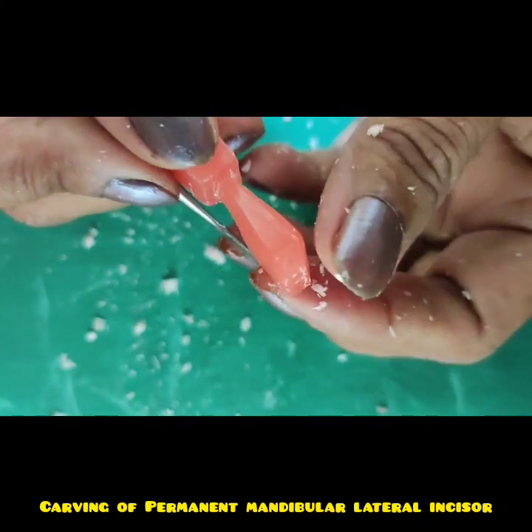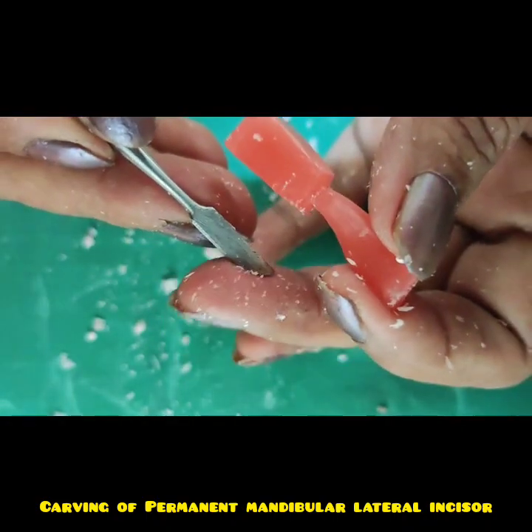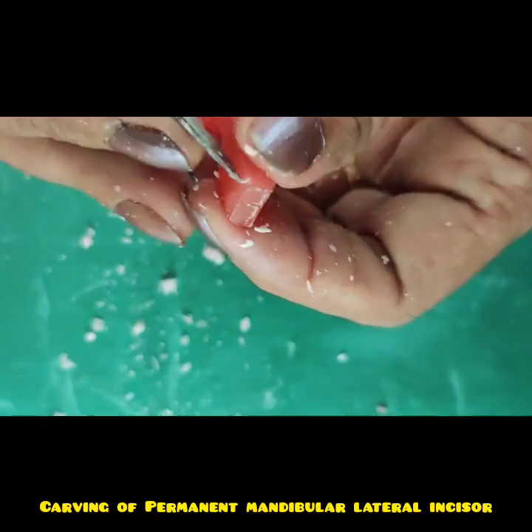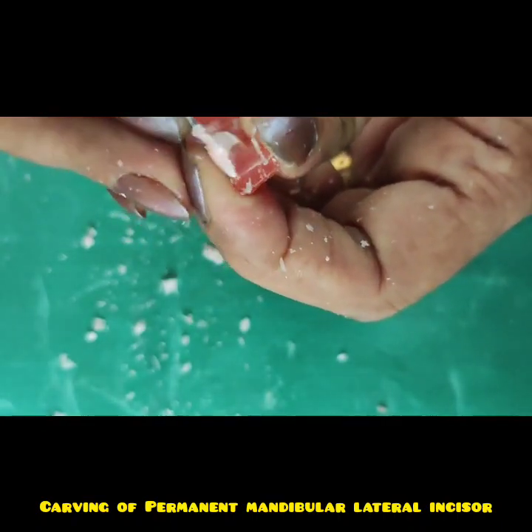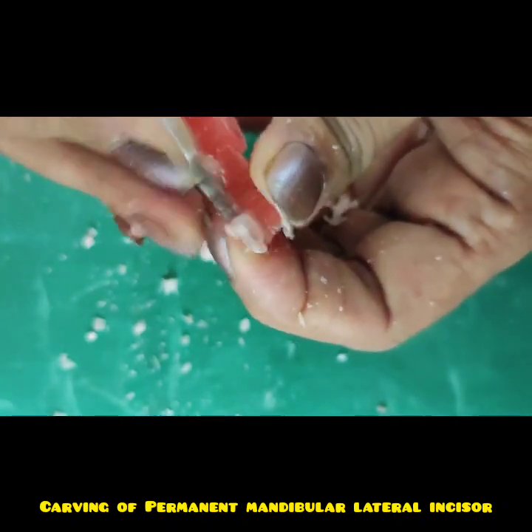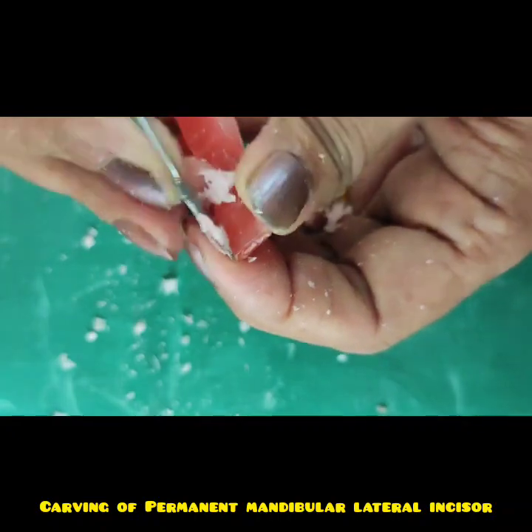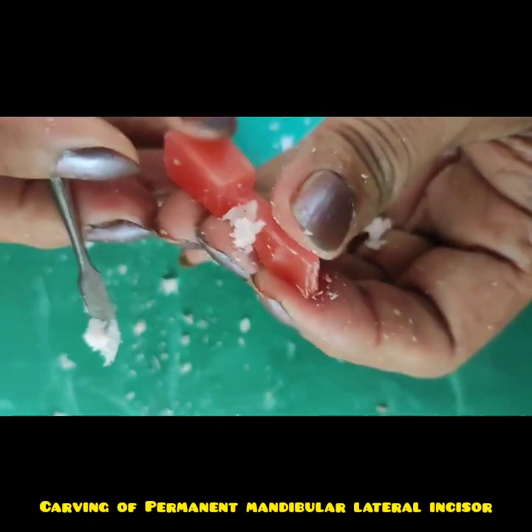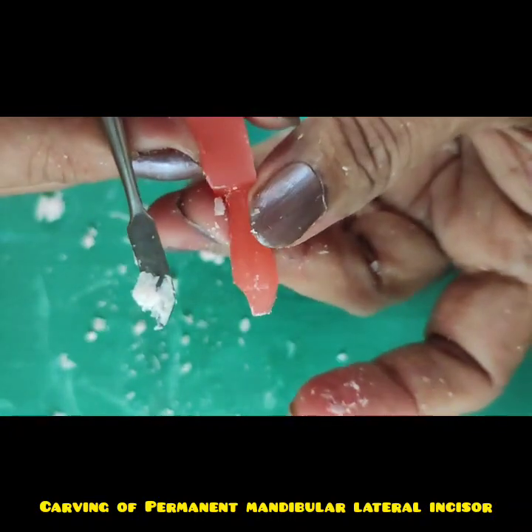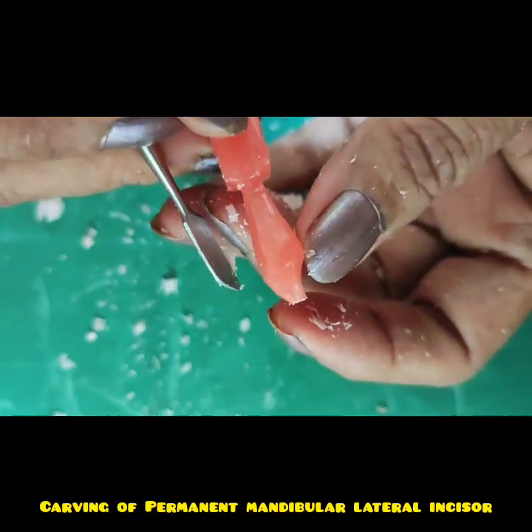And similarly on the lingual side also, I will use the convex portion of the carver to create a concavity. So here the upper 2/3 I will reduce, and I will use the convex portion of the carver, which is a cutting edge, and I will move it between my thumb and index finger. So this is how my lingual and labial surface is done.